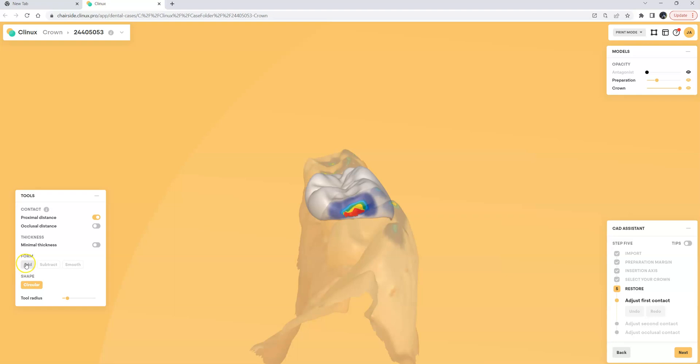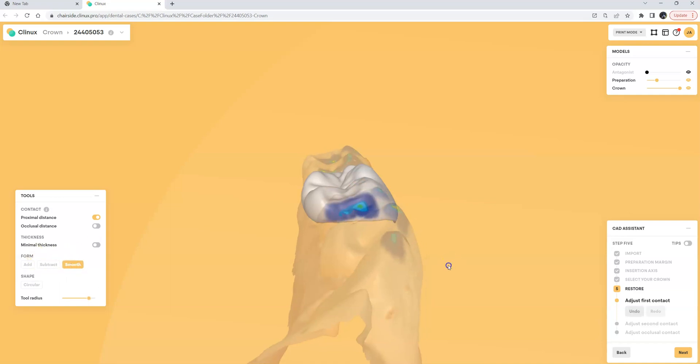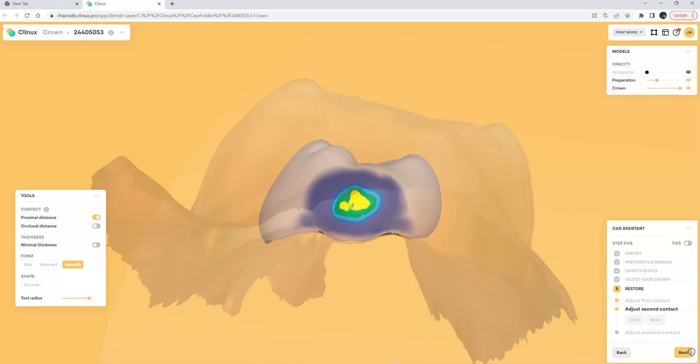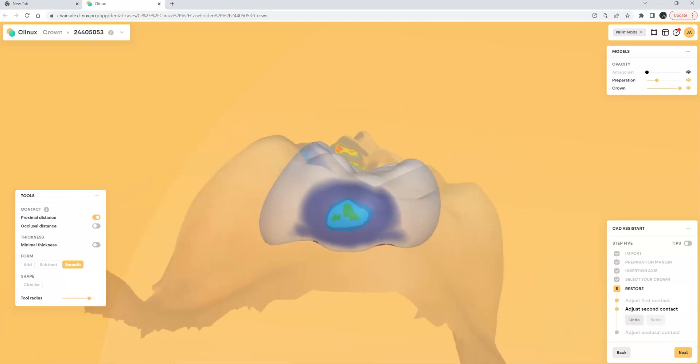I can use my form tool add, subtract, or smooth so for example if I wanted to subtract a little bit of contact here then I can change the radius of the tool as well I can make it bigger or smaller and then I can smooth out some of the areas and make everything look nice and smooth. We can go ahead and click Next it'll bring us to the other side contact and that looks pretty good.